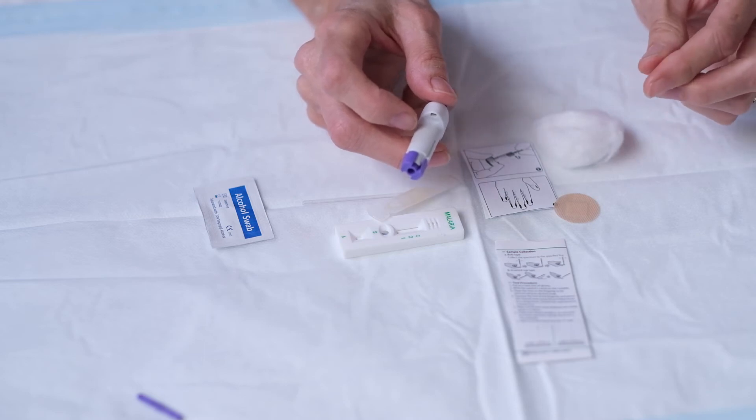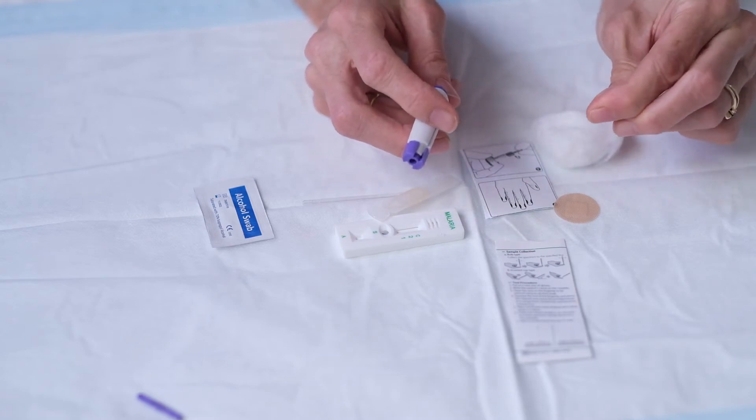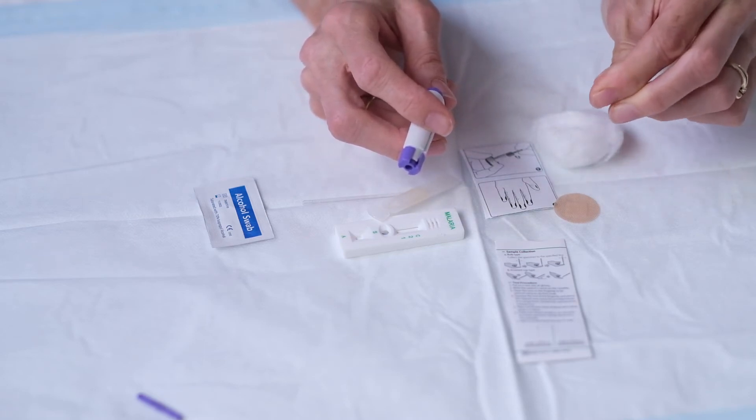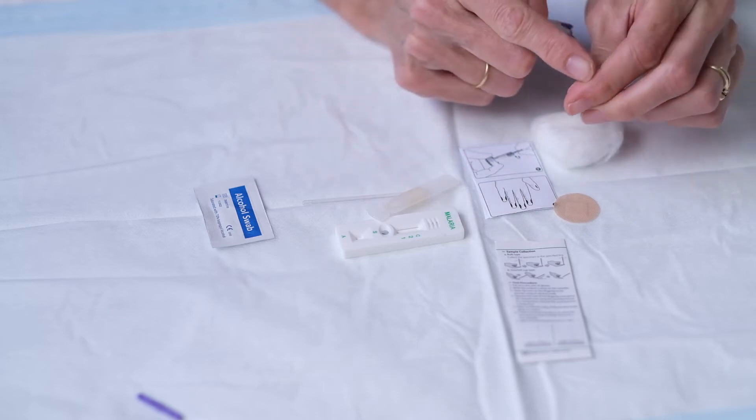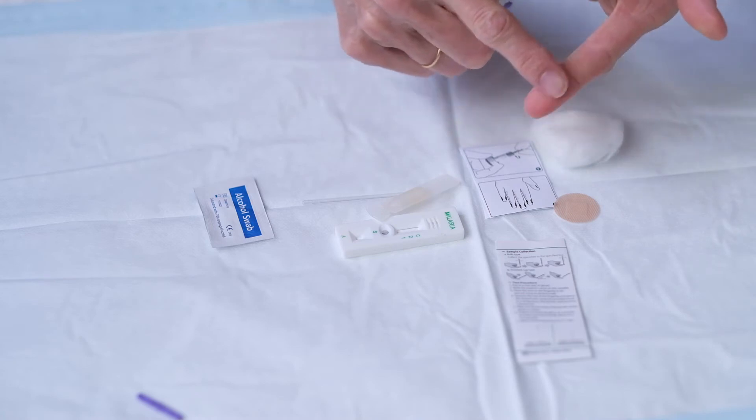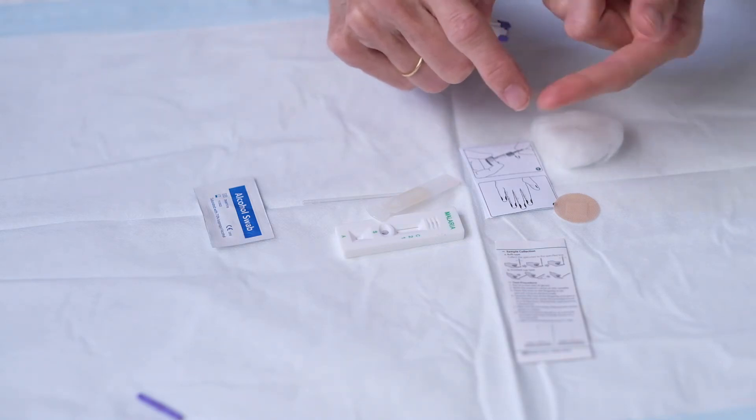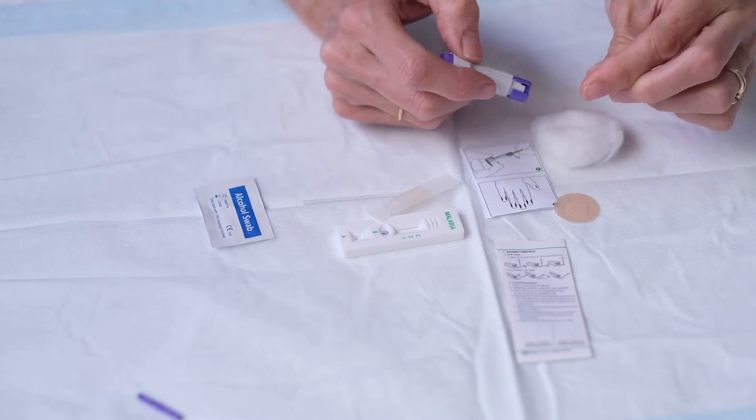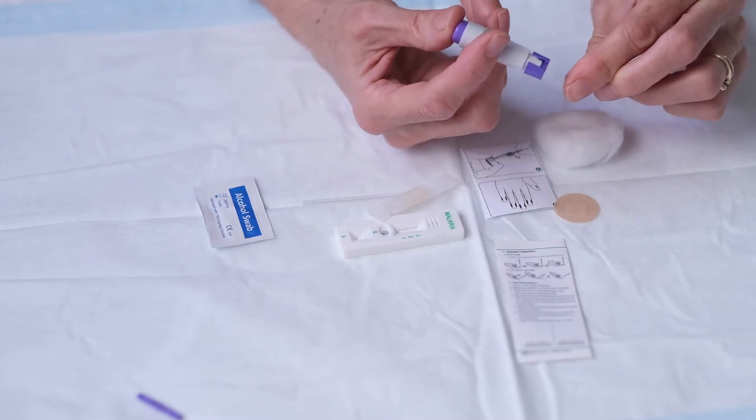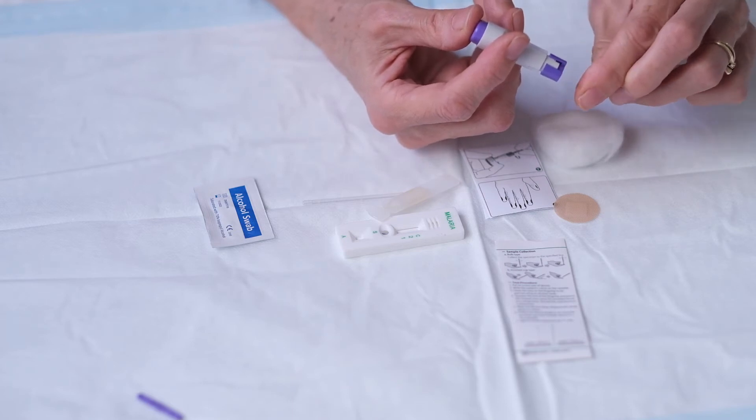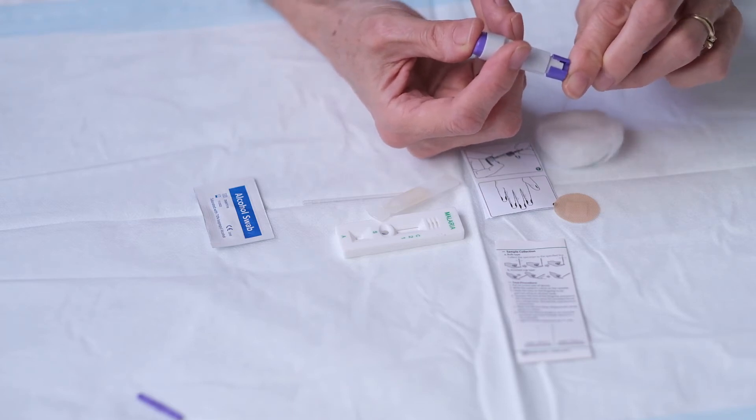Now for your finger or the person's finger that you're going to use, you need to sort of pump your finger a little bit and it's really important that you do the side of the finger. You do not want to do the front of your finger. There's a lot more nerve endings, it will hurt. If you do the side of your finger then it will just hurt a little bit less. And all you do is you get the stabber or the lancet and you put it on the finger and then you just push the button.